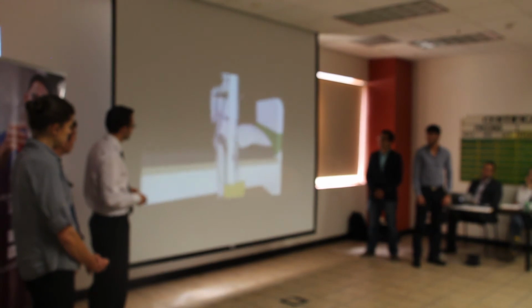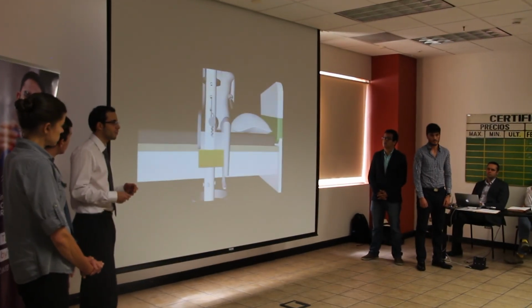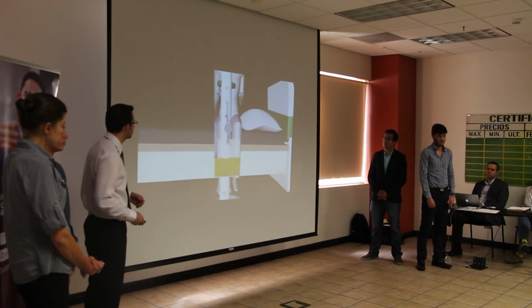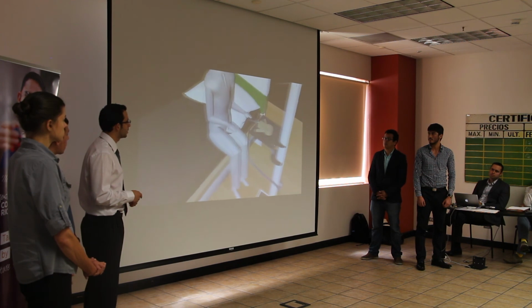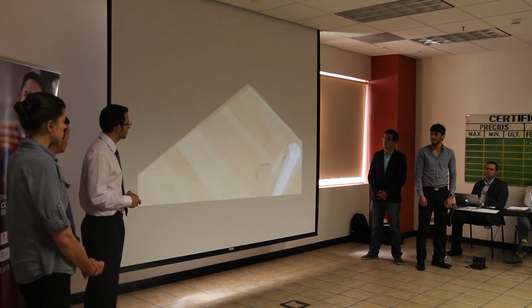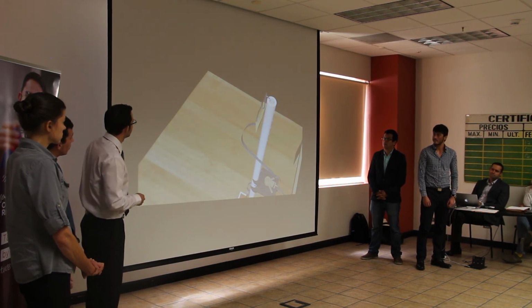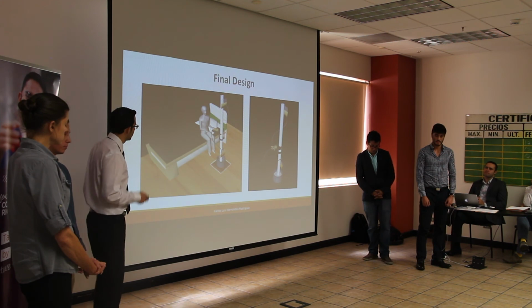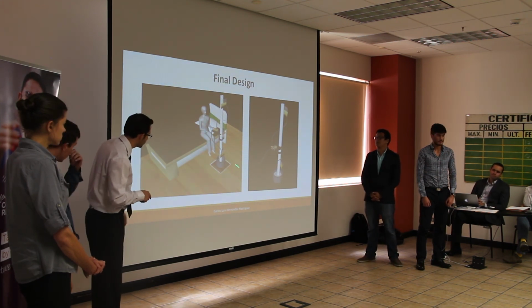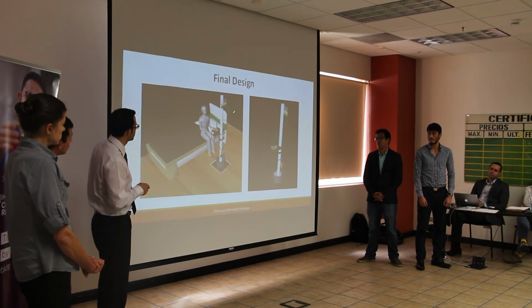As you can see, this is the patient scale. We use the patient scale because it is more affordable for the patient. There is a regulator. To sum up, our 4 main pieces are the base, the table, the patient scale, and the regulator.